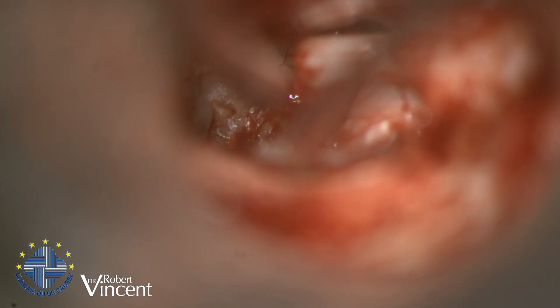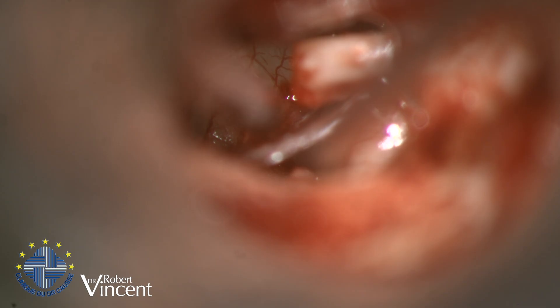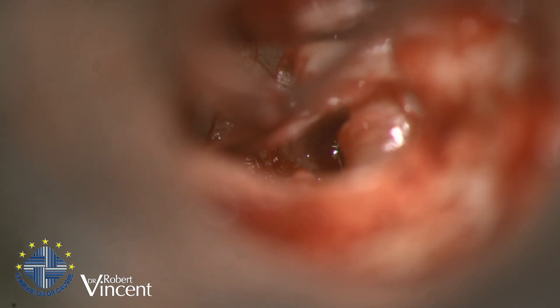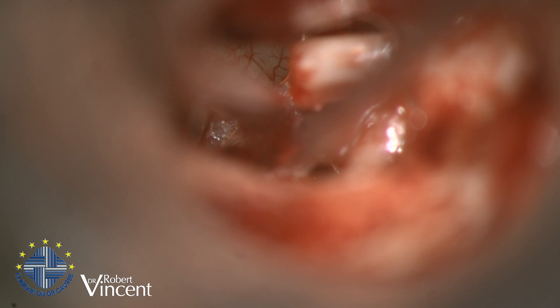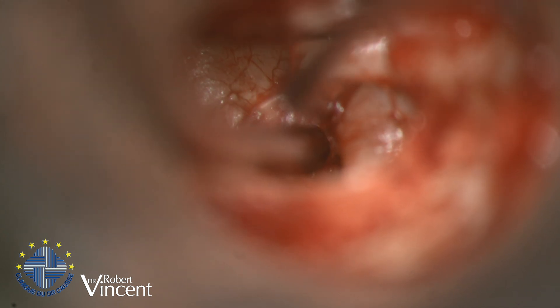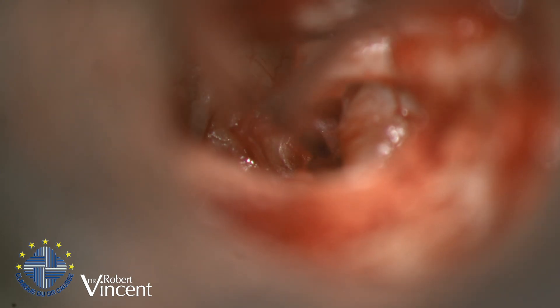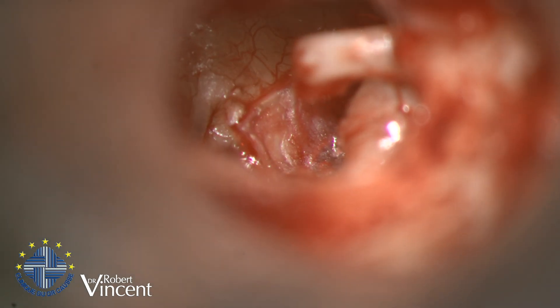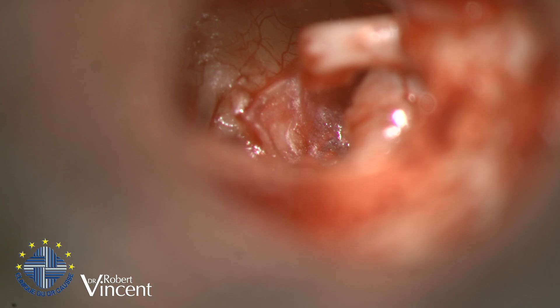It's pretty dry but it's going to go much better soon — it will get wet by itself, but I don't want to make it too wet. Taking my time, the vein is going down. You can see the position of the fenestra right here. Now let's try with the new titanium bucket prosthesis.